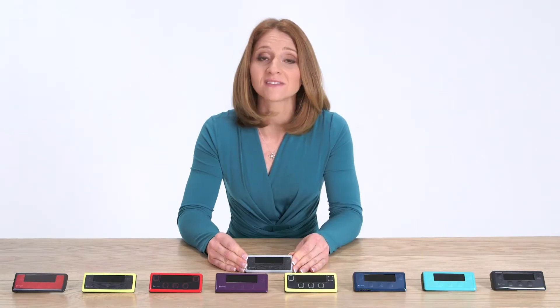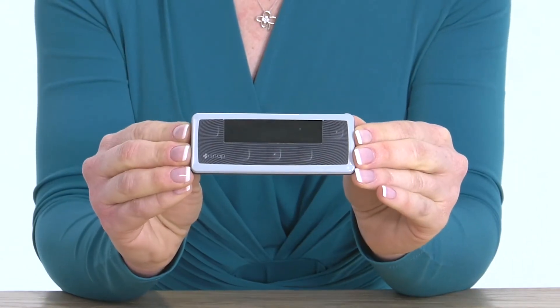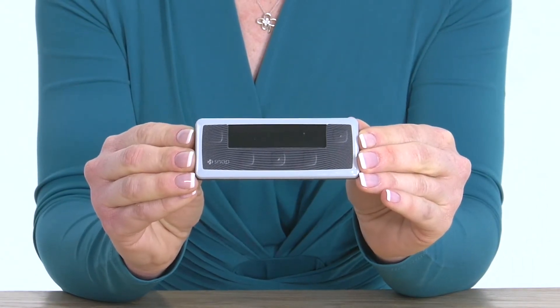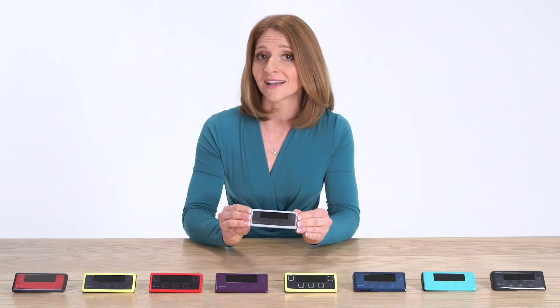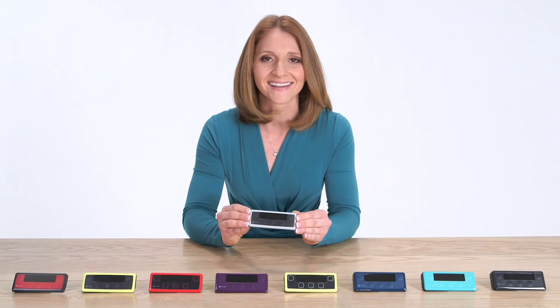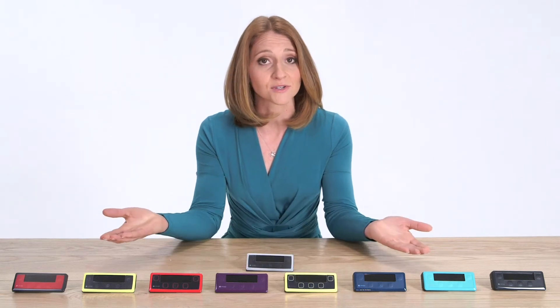I'm going to show you a few of the pieces that you'll need for the setup of your SNAP. This is the controller which houses the electronics of the pump — what I refer to as the brains of the pump. This is mine that I custom designed to be gray in color. You'll also notice that there are several different color options to choose from.